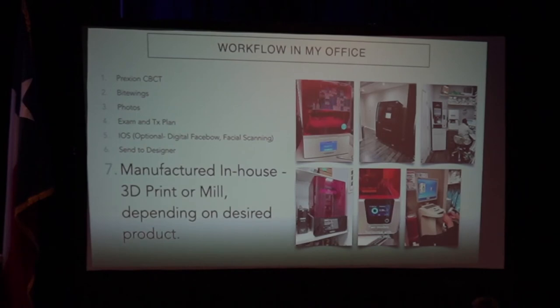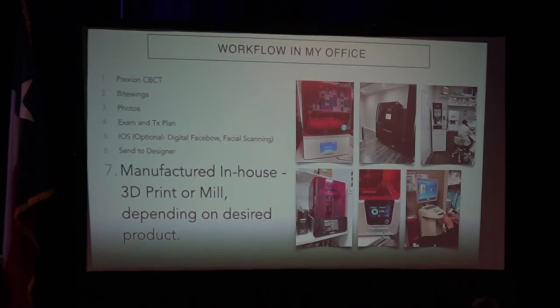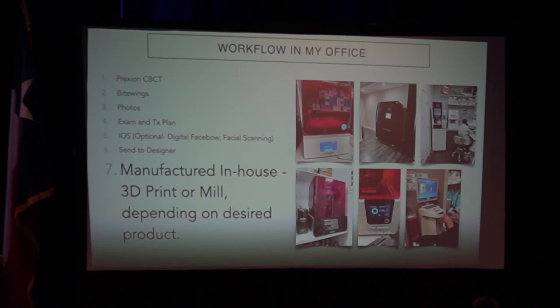Is anybody confused on that part, or anybody lost on the steps we're going through? So digital dentistry is pretty much all of our analog workflows in a digital world. We don't skip that many steps. You have to understand the analog steps to be able to do the digital steps.